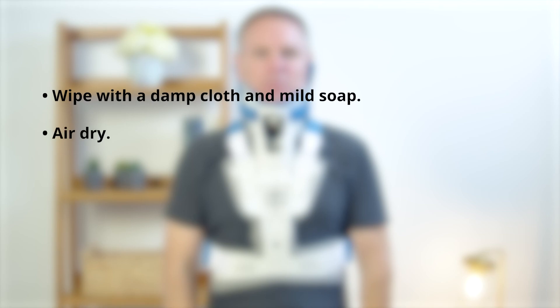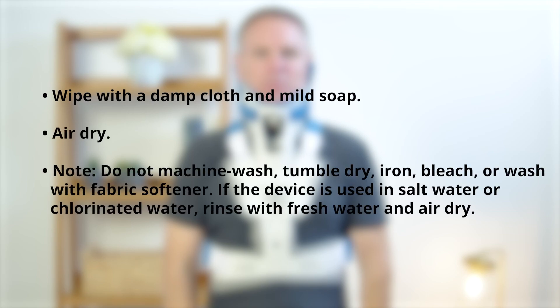Wipe with a damp cloth and mild soap, then air dry. Do not machine wash, tumble dry, iron, bleach, or wash with fabric softener. If the device is used in salt water or chlorinated water, rinse with fresh water and air dry.